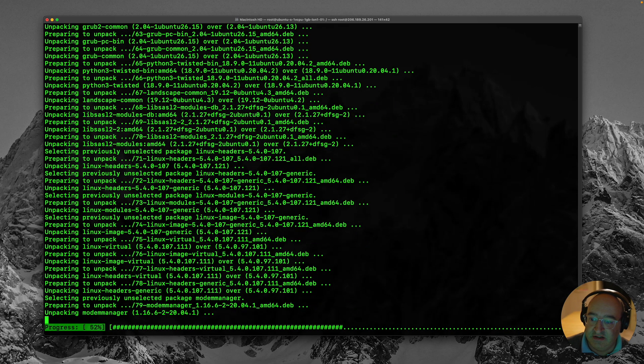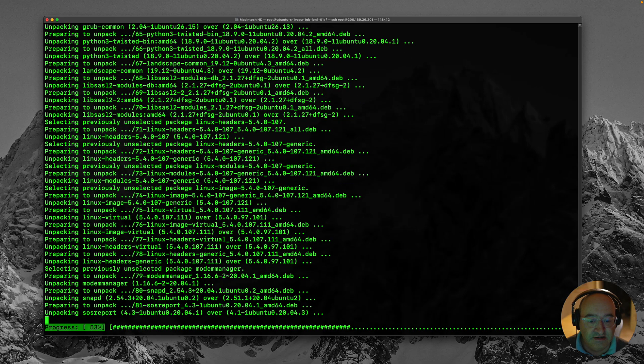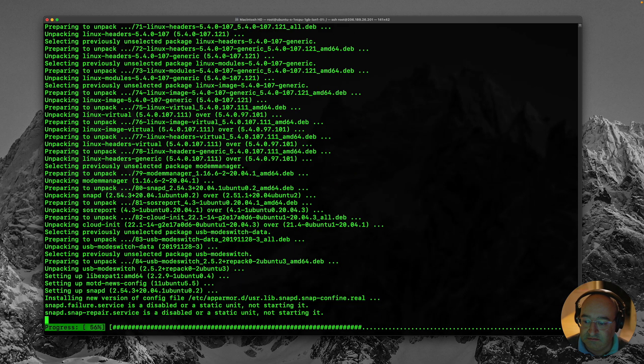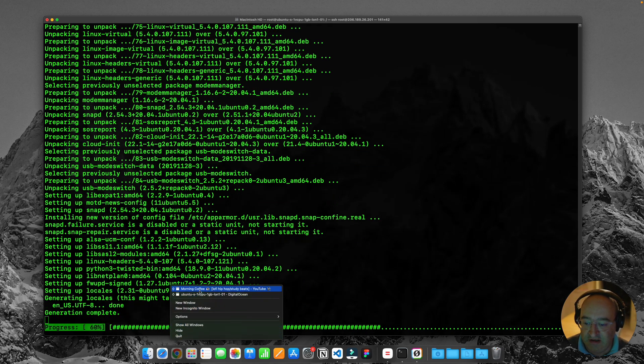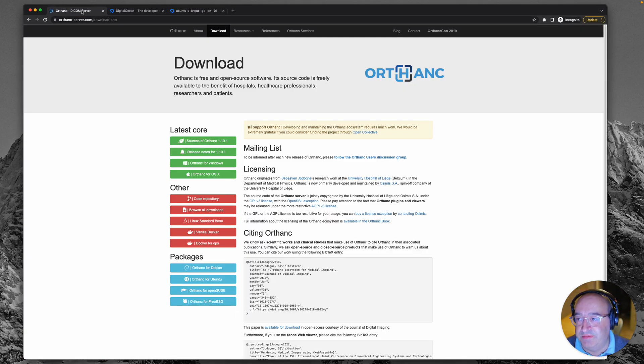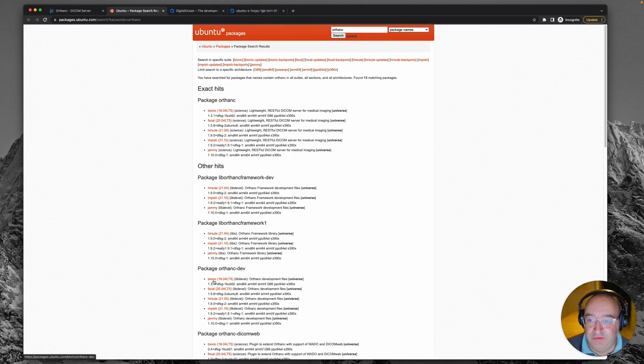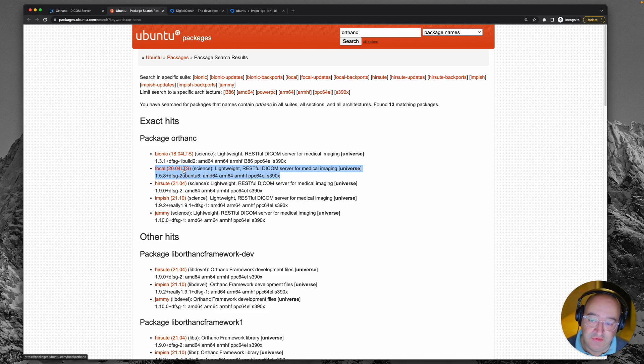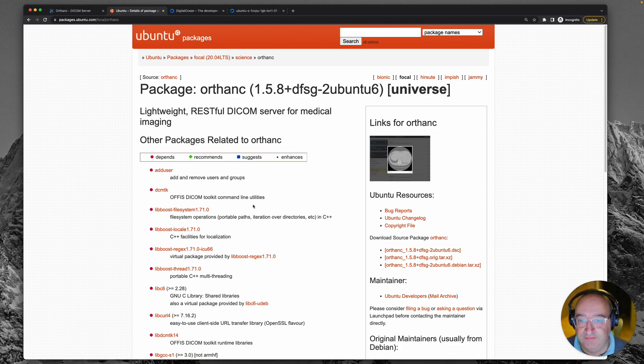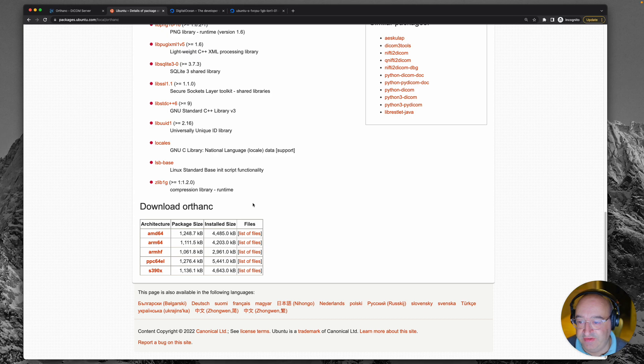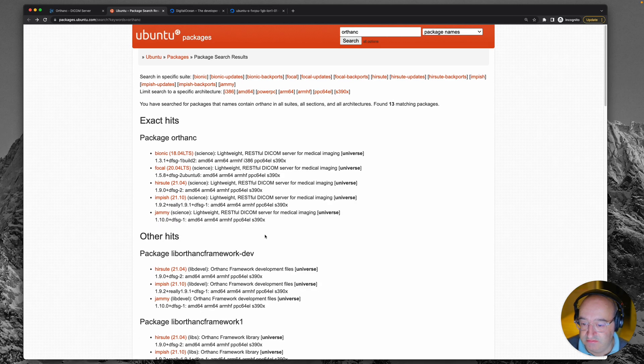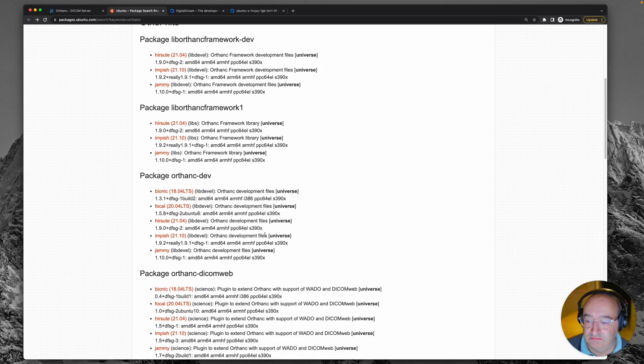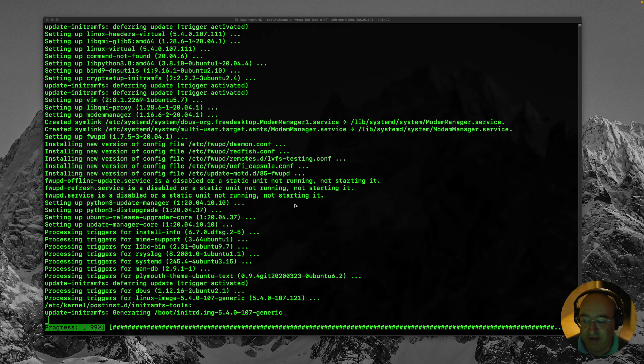Now when it's done this we're going to work on installing some of the things which Orthanc needs. So let's just go back to the Orthanc website while we're doing that. We're going to use this version Orthanc for Ubuntu and you'll notice here that there is a version for the 20.04 LTS version which is what we have put on our server. So we'll pick that version. This is just a real big list of everything that's in the package. Okay let's go and see how that installation is doing. 99%.